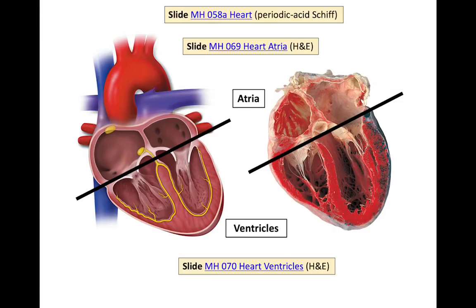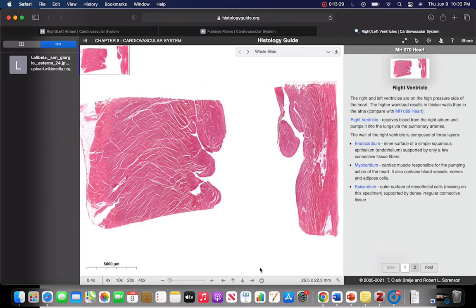And we have also H&E staining of the ventricles. In H&E staining, the Purkinje fibers appear pale. Normally, as you know, H&E doesn't stain glycogen or carbohydrates, so the cells will appear pale. So here, this is the left ventricle, and this one is the right ventricle. You can see the difference in the thickness of the left and right ventricle. The left ventricle distributes blood throughout our body, so there is functional hypertrophy. Roughly, the wall of the left ventricle is 3 times thicker than the right one.